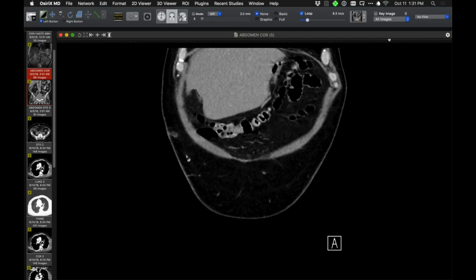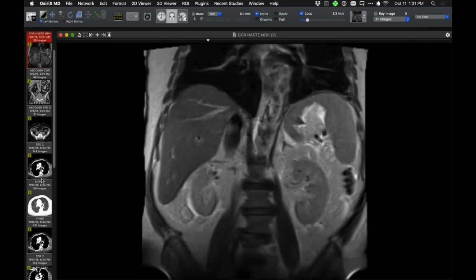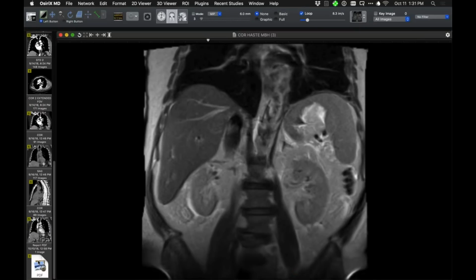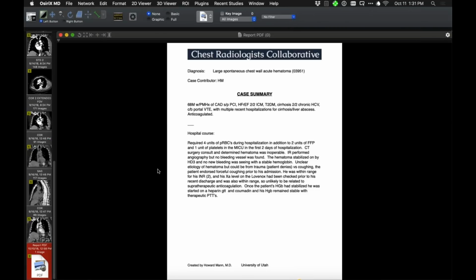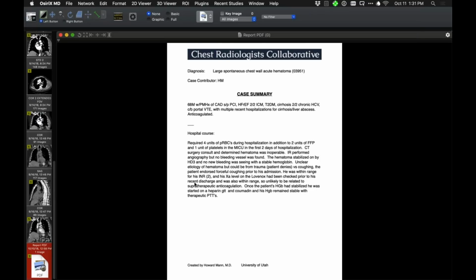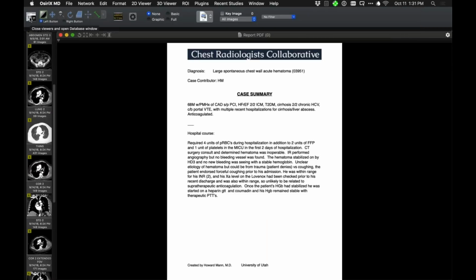And we also had an MR showing the absence of it, as you can see there. So that's a large chest wall hematoma, acute hematoma, a lot of blood in there. And now I'm trying to remember what the etiology was thought to be. So here is some history. They didn't get a clear history of trauma. There was some forceful coughing prior to admission. Interestingly, it was on anticoagulants, but these levels were okay. So just a large chest wall hematoma. Don't know why it developed, but obviously not a sarcoma.